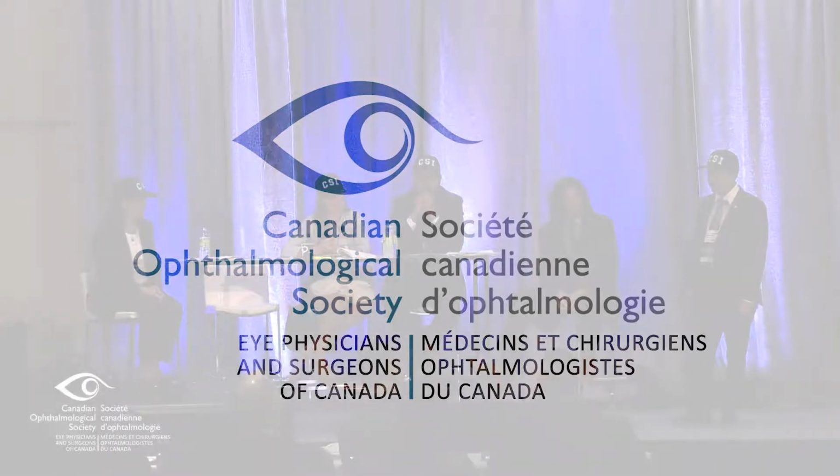Cataract surgery was performed on a patient who had an ICL in, yes, right? So what formula did you use to calculate the IOL power in this case? The same. I don't make any... You mean in terms of taking into account that the ICL is there? Yeah. I think we used the Barrett in him, and I used my usual strategy.